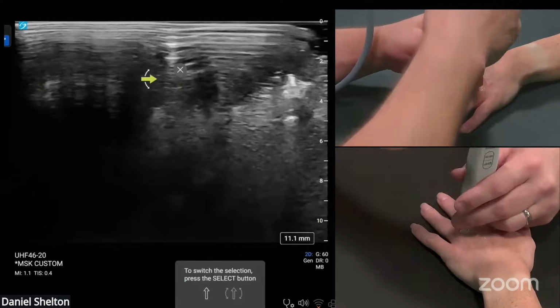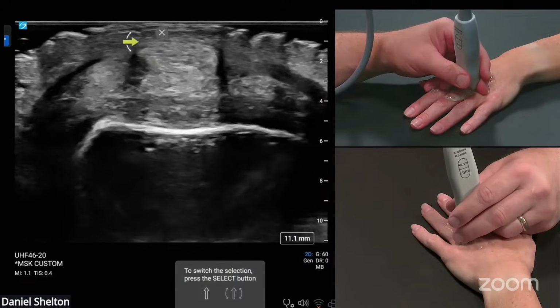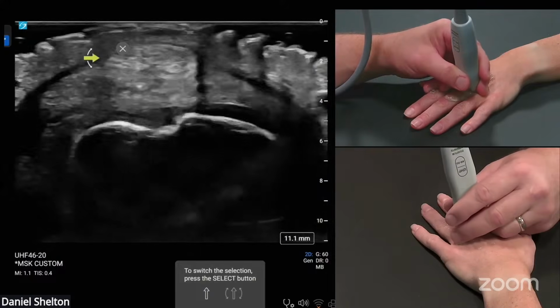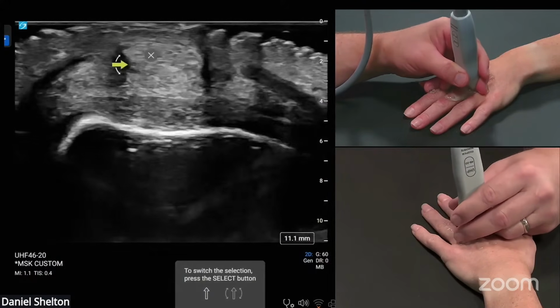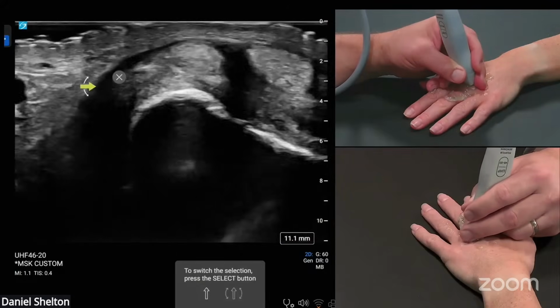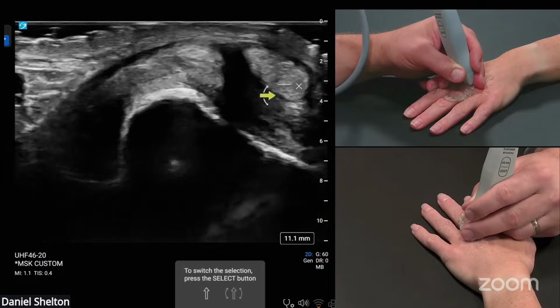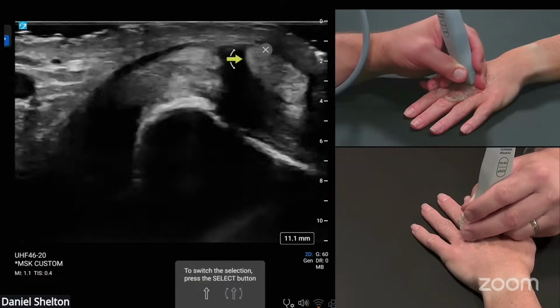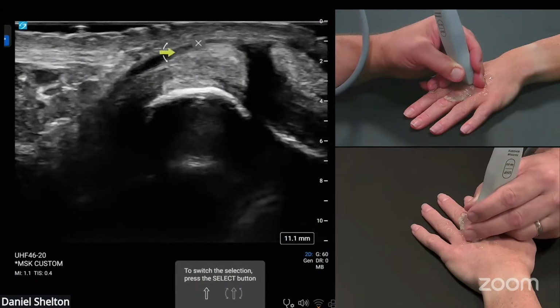Let's go short axis to appreciate the sagittal band anatomy. We've got extensor tendon here, superficial sagittal band, casting a really hard shadow because of the fine, very thin nature of this ultrasound beam being 46 megahertz. Anisotropy is a little bit more prevalent with this probe. Tilt the transducer and aim down the side. So we have extensor tendon, deep sagittal band, shadow of that extensor tendon coming in with the deep and superficial sagittal band. And then you can trace the superficial sagittal band down here.